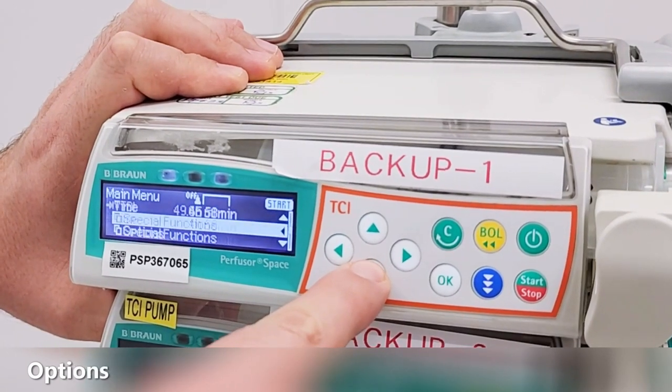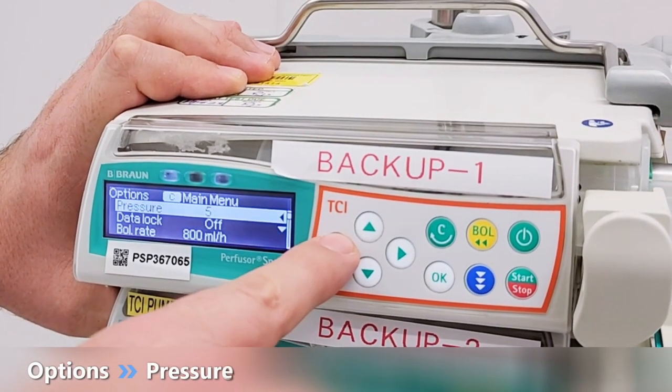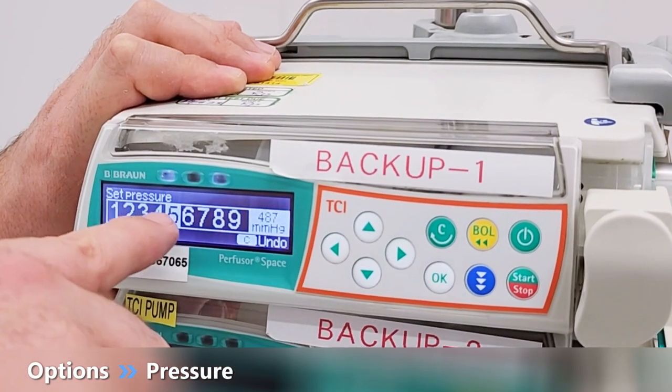To increase the pressure limit in case of an occlusion alarm, scroll down to options and use the arrow right to set higher pressure. Then confirm.